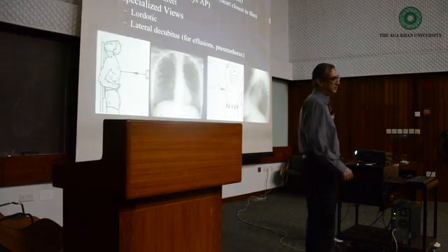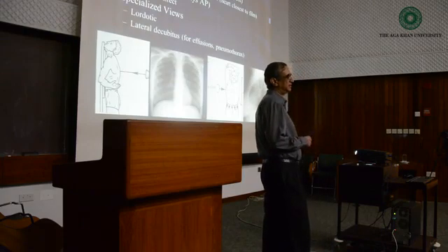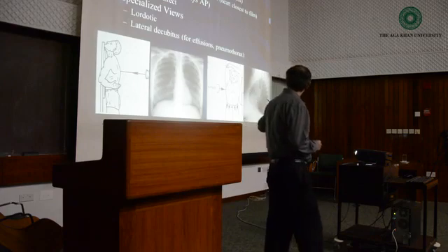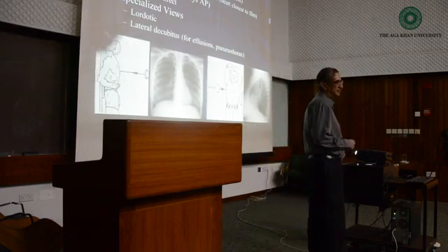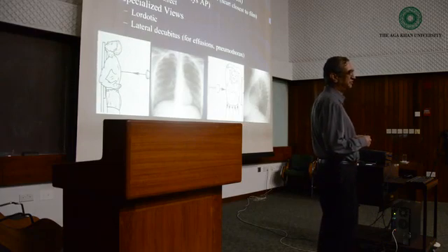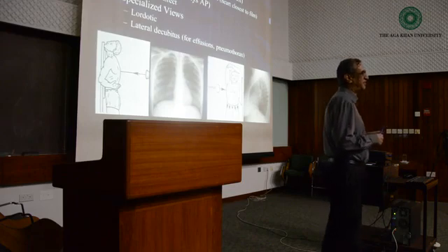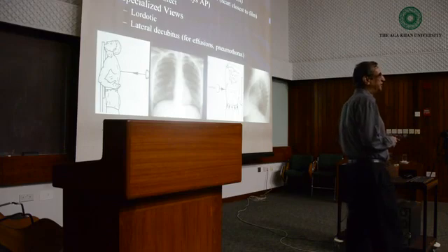So it gives you the depth or where it is located in the second dimension, because this is a two-dimensional structure, but it's not represented. Depth isn't here. So until we get 3D X-rays, we'll have to do lateral views. But if we one day get facility for doing a 3D X-ray, maybe we could do away with lateral.